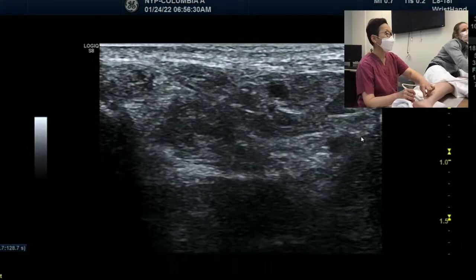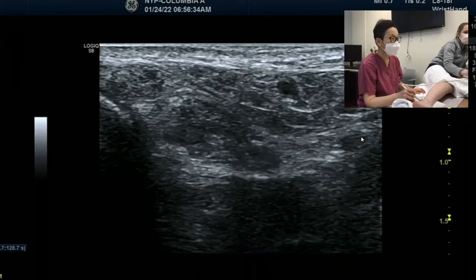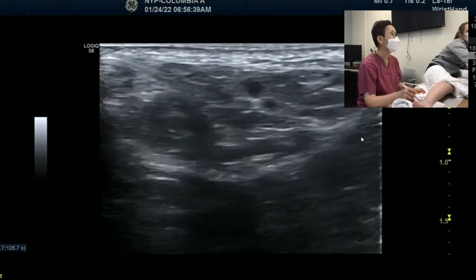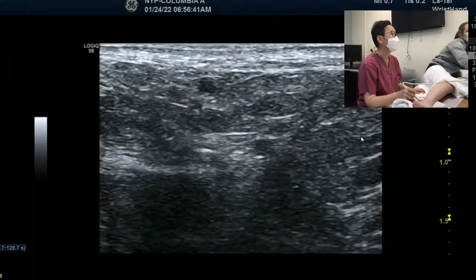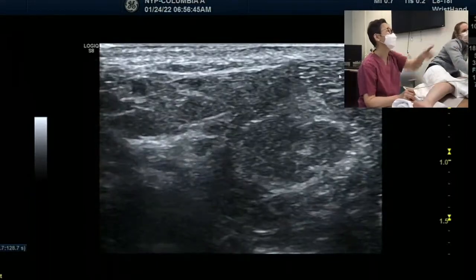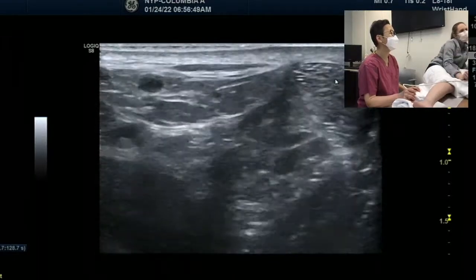And then if I move toward the Achilles tendon area, whenever you look for the sural nerve, you have to put your probe between the lateral malleolus and the Achilles tendon. The Achilles tendon is this one. I'm moving to the more medial side. So that's the Achilles tendon. The texture is white. Do you see it on the top? Yeah, that's the Achilles tendon.